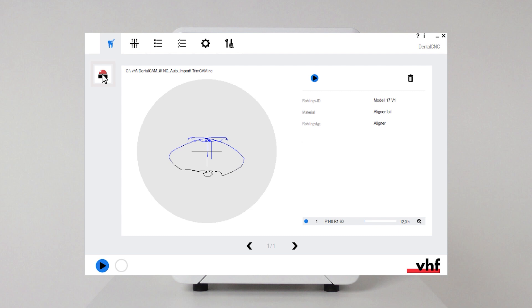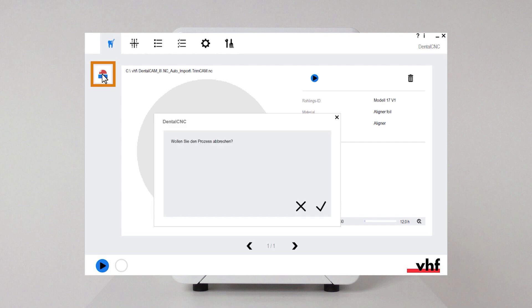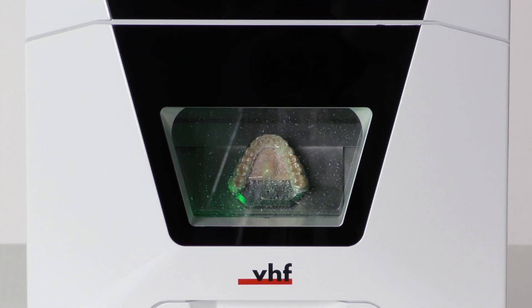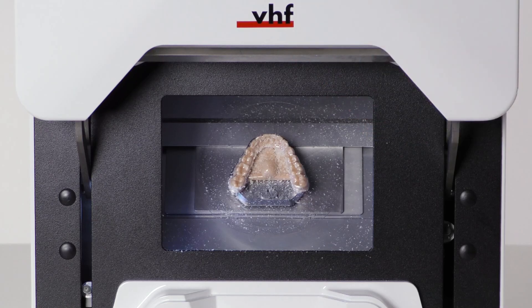To abort machining, select the depicted icon in dental CNC. Confirm the message. Machining stops and the spindle moves to its default position. You can open the working chamber door.